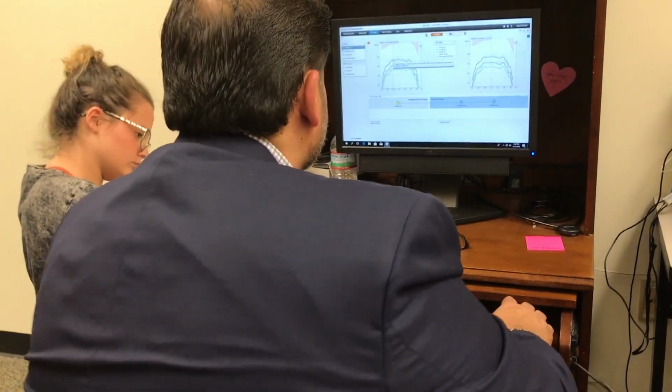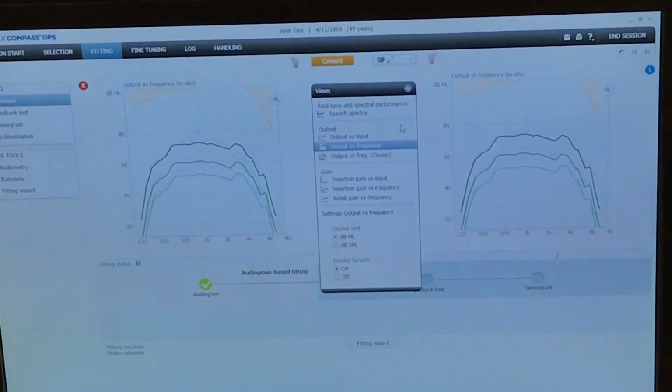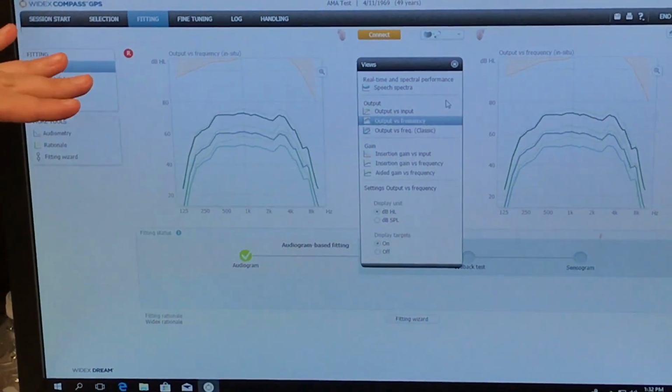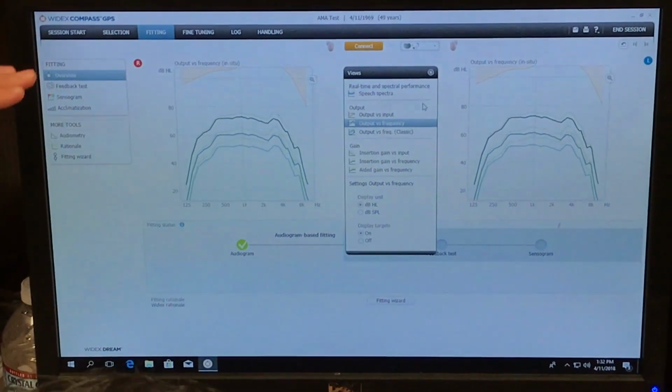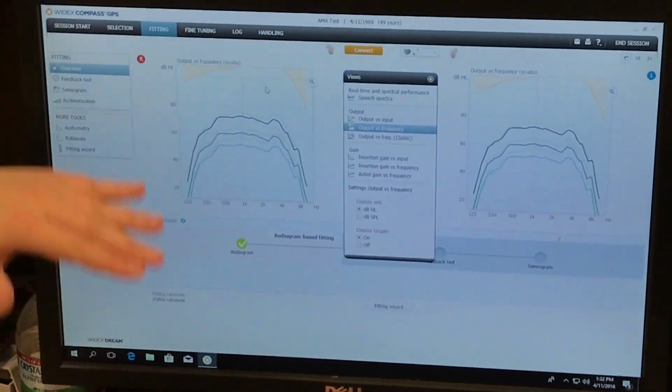So let's look at this. So I'm going to go in here and click on Views. And of course I can't. As you get closer to, is it the MCL or the UCL? There's nothing here. There's no MCL. I know, but as I get to the top is UCL.